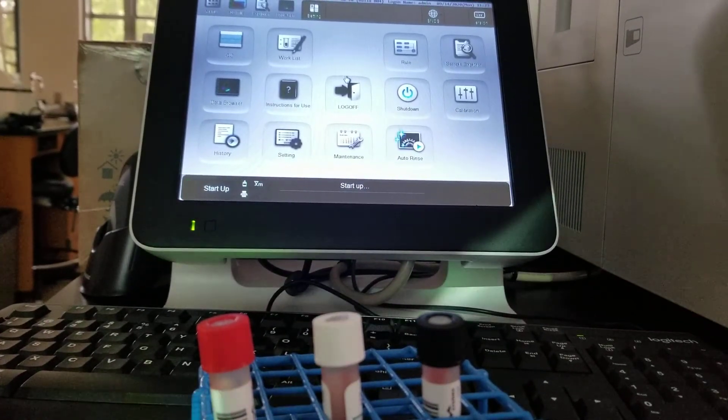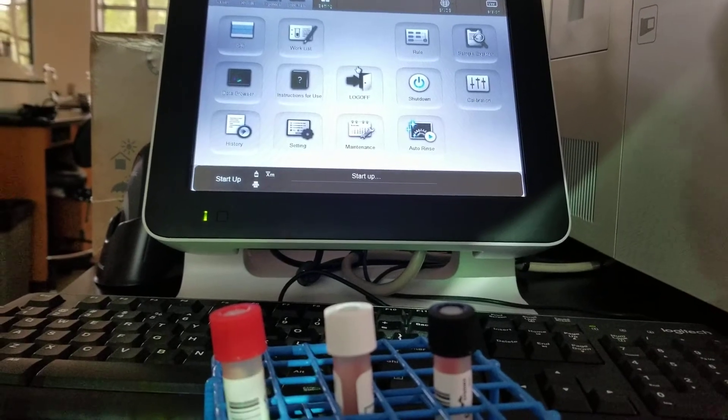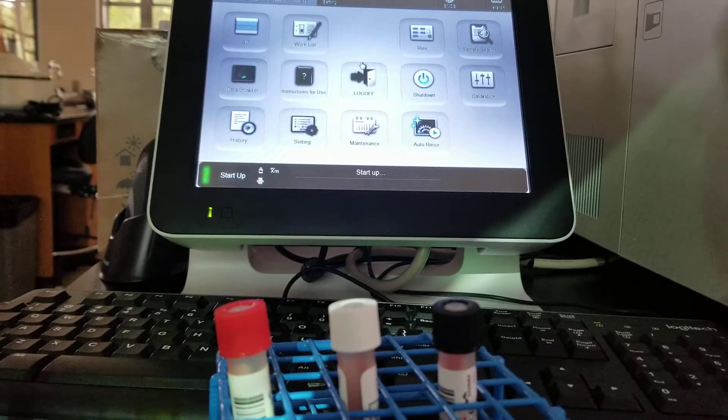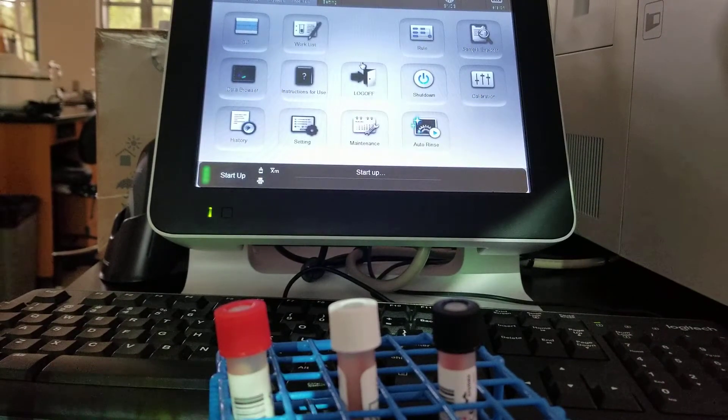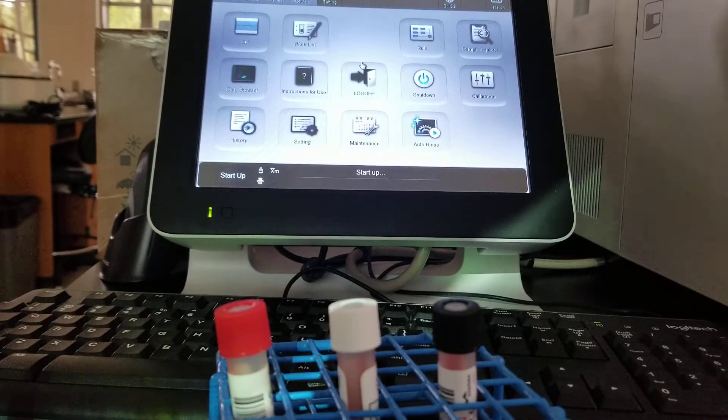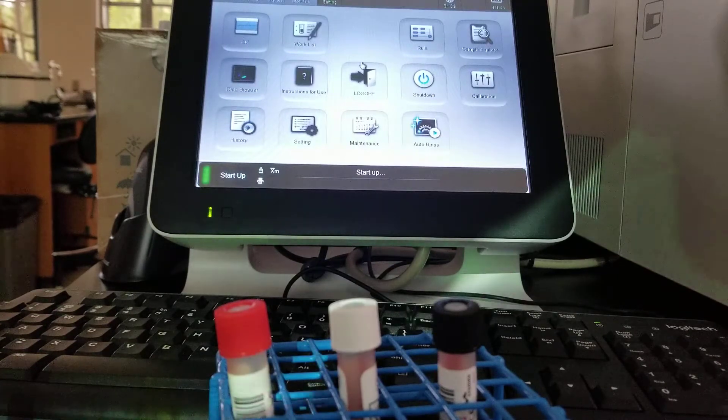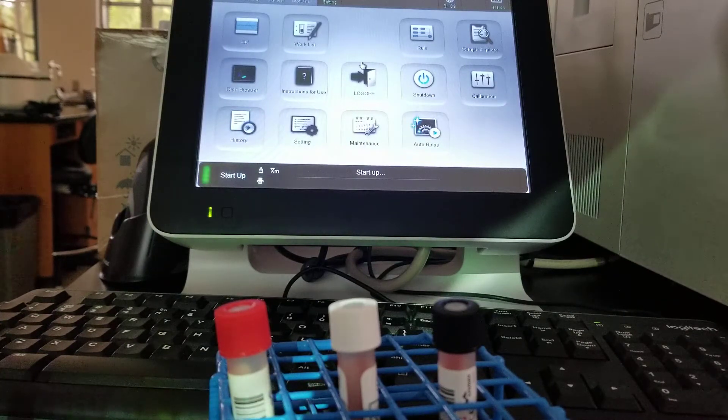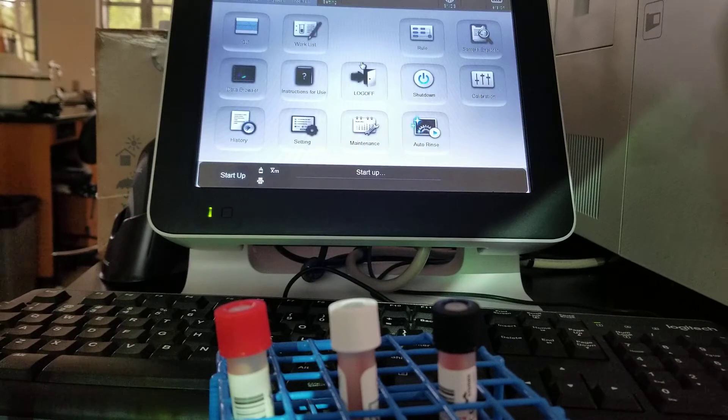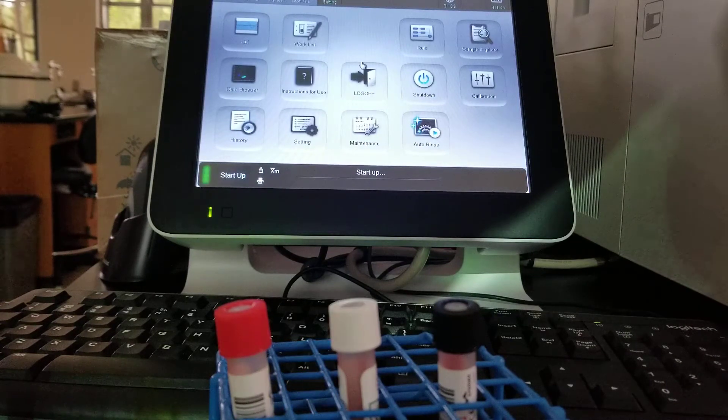The manual analysis is when you don't have a barcode on the specimen or you have a stat. You can manually put in the specimen information and that's what we're going to have you do in class.